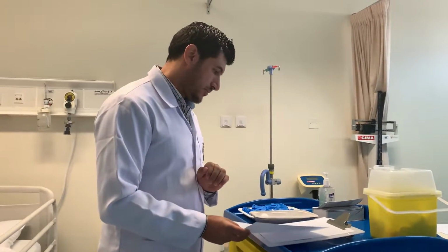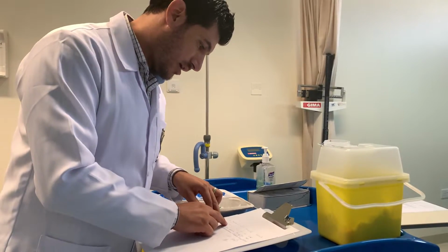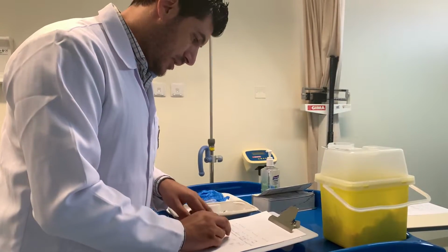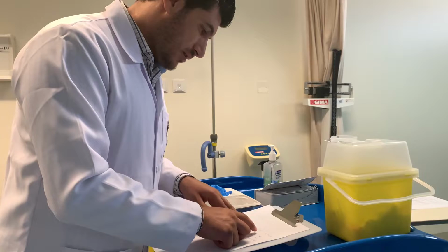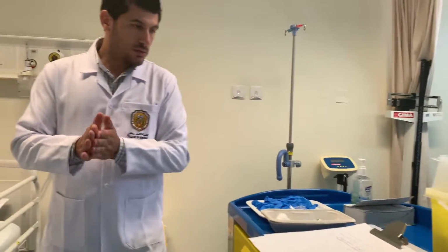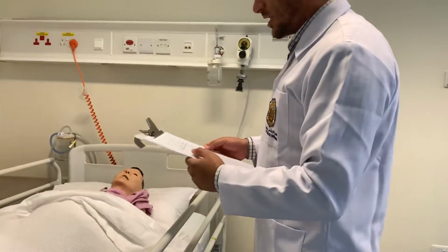checking on the order. So it is Mr. Muhammad Saif Hamid. His ID is 46225. He has to have a heparin injection 5,000 international unit 1 by 1 daily for 7 days starting from today. So the order is valid, and the order is to have this 5,000 international unit subcutaneous, starting from today. So we need to first go and check with the patient to make sure that he is the right patient, and that the patient is eligible to have this injection.